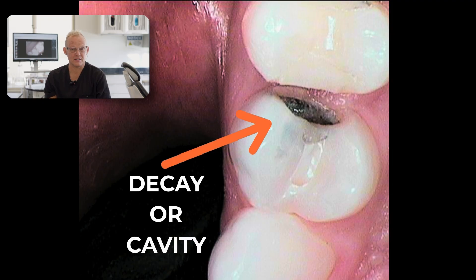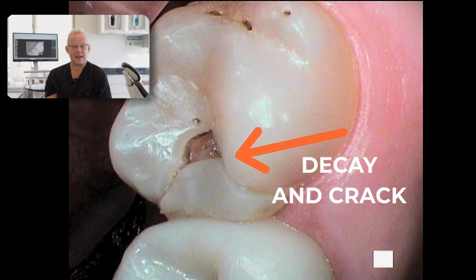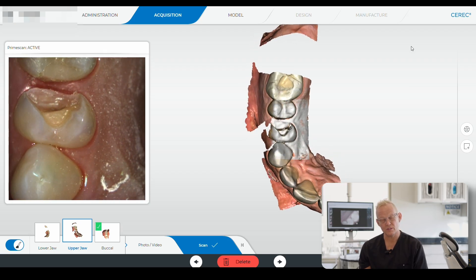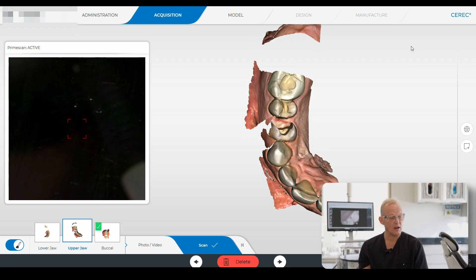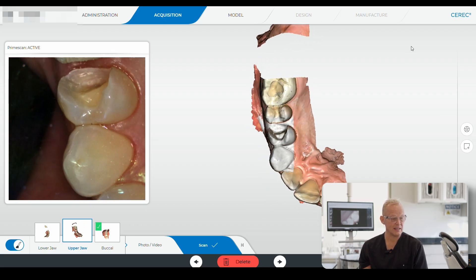Three different crowns are being done on this patient, who had a lot of decay on each one of these teeth, and a crown that was done poorly by another dentist with decay underneath it. We removed the decay and produced a crown on the same visit. I'm doing digital scans to produce the restoration.